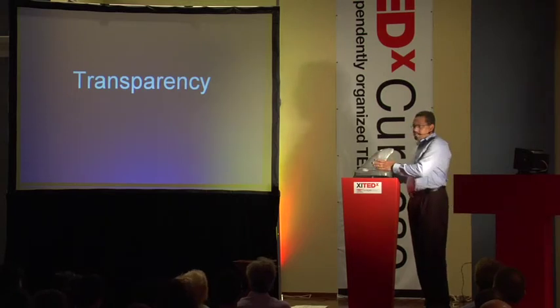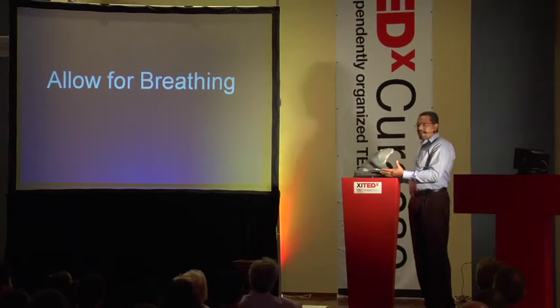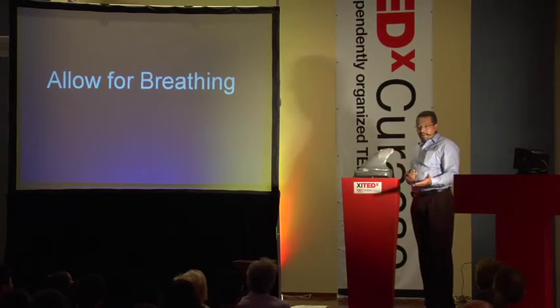Now, if you have a wound, you want to see it from the outside. So the device also had to be transparent so you could notice if anything would go wrong. And a big animal like that, it's a mammal. So the trunk has to be able to move with the device on for the breathing process. So also in this direction, the device needed to be flexible enough.